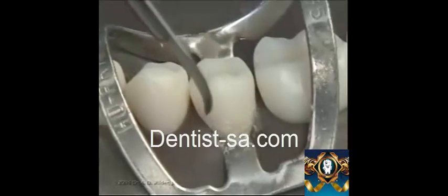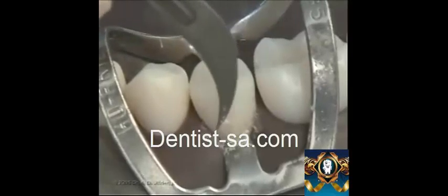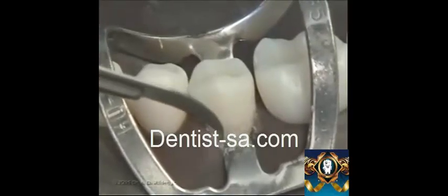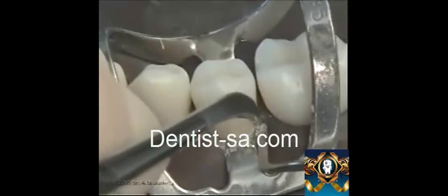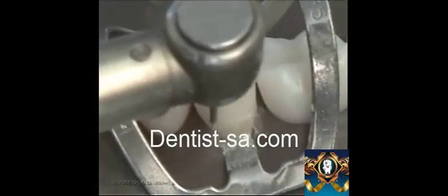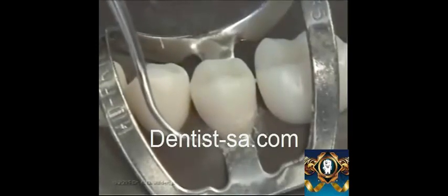A BP blade number 12 could be used to remove the excess flash of composite. This should be done in a very careful manner so as not to fracture the composite restoration or tear the rubber dam. BP blade application is continued to remove the excess, and any roughness could also be removed. Contouring is again initiated using a tungsten carbide 18 to 24 fluted burr. Composite is again evaluated using the explorer. This is done at each stage.